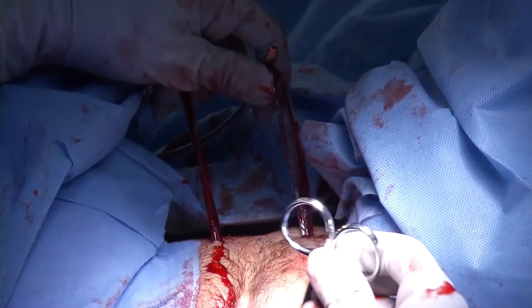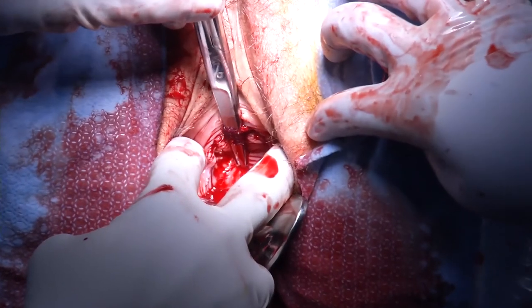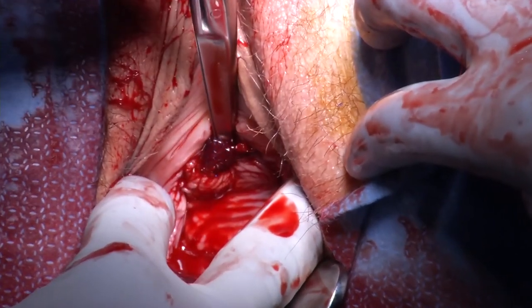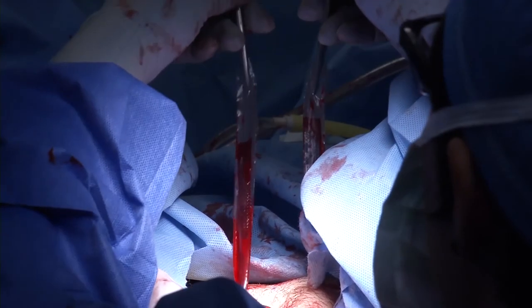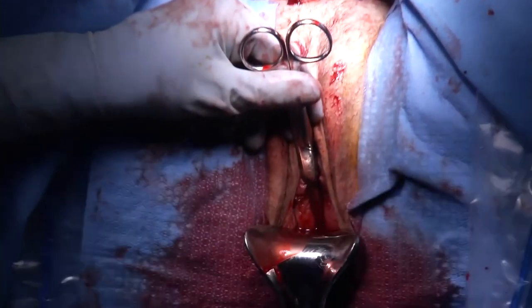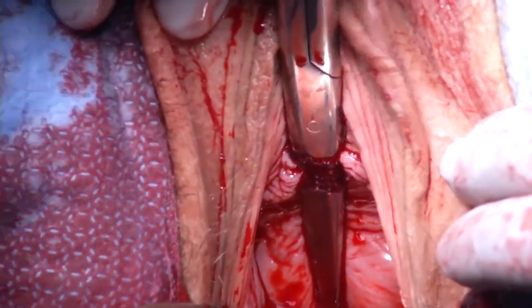A straight Mayo scissors is placed between the urethra and sling to aid in tensioning the sling. Typically in hypermobile patients, we leave a small air loop under the urethra to ensure there is no real tension under the urethra. After the trocars are cut off, straight hemostats are placed on the sheath of the sling, which are removed while aiming anteriorly and towards the patient's head in the vector of the sling placement, while the assistant maintains counter tension on the Mayo scissors under the sling at the mid-urethra. A moderate loop of mesh can be seen.